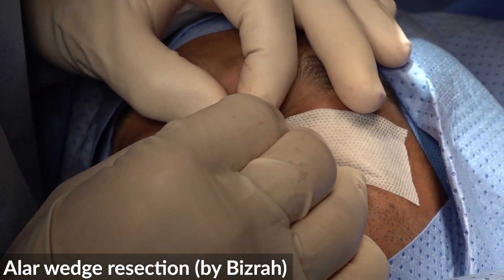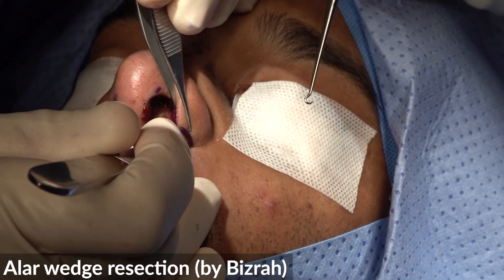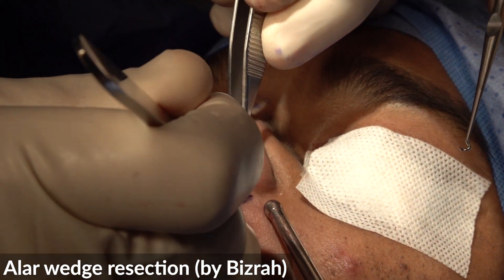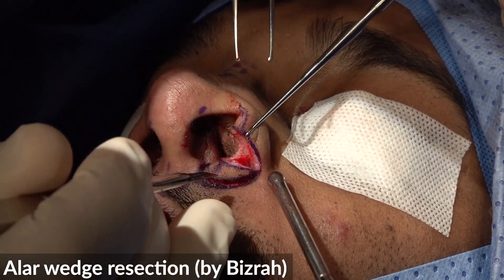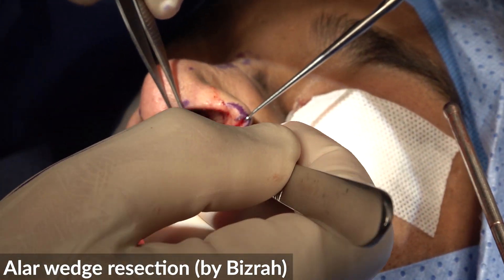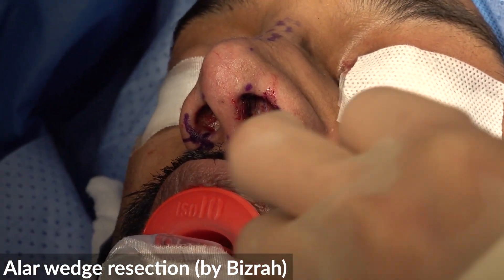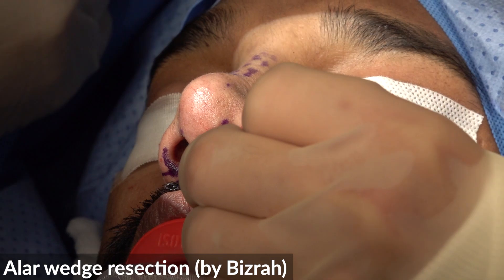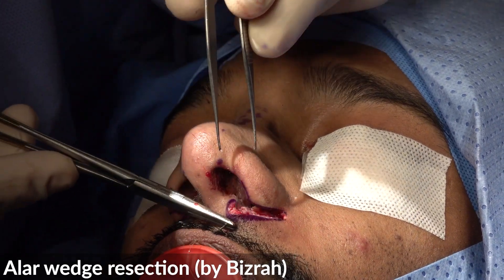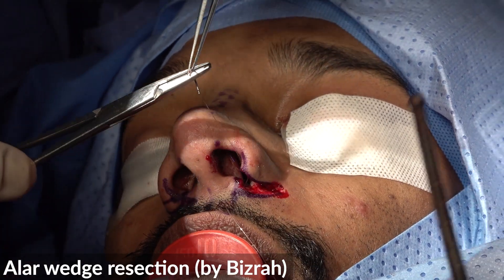That's good. Full thickness skin, again, full thickness skin.